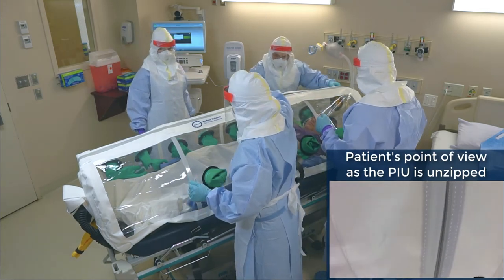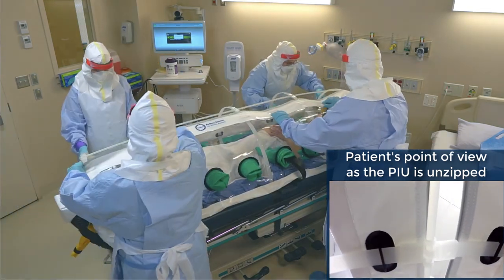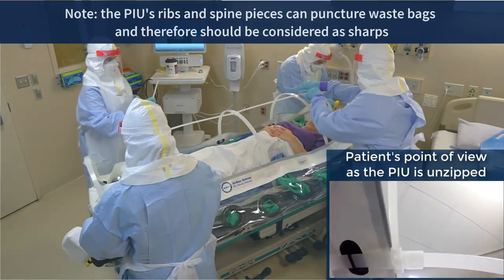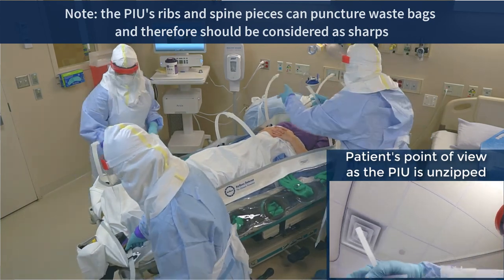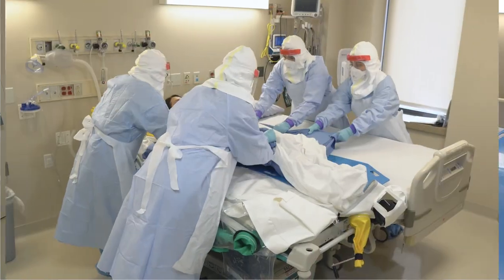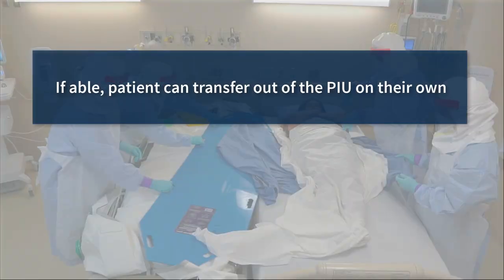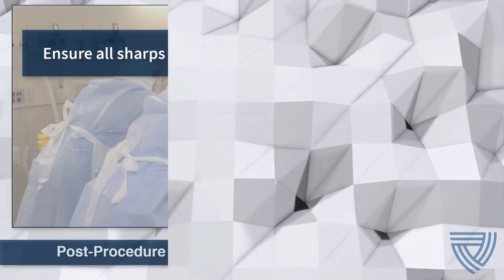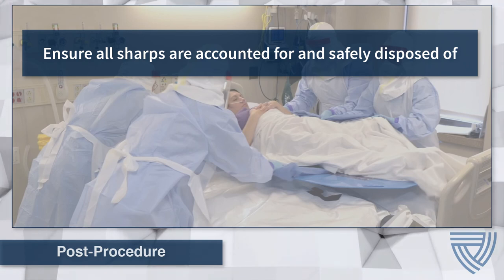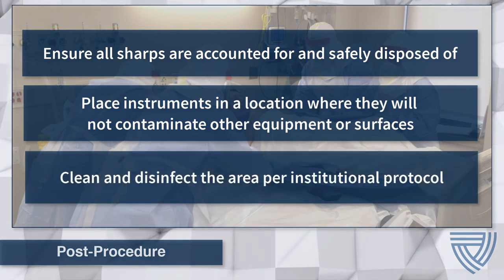Unzip the PIU, being careful not to snag or tear gloves in the zipper mechanism. Turn off the blower motor and disconnect all tubing and monitoring equipment. Transfer the patient from the PIU per the manufacturer's instructions, which may involve disassembling the canopy by removing the unit's ribs and spine. Transfer the patient to the bed using a slide board if necessary, or allow the patient to transfer with assistance if able. Depending on the duration of transport, it may be necessary for the patient to sit on the edge of the stretcher to regain equilibrium after lying flat. After the procedure, ensure all sharps are accounted for and safely disposed of, all instruments are placed safely, and the area is cleaned and disinfected per institutional protocol.